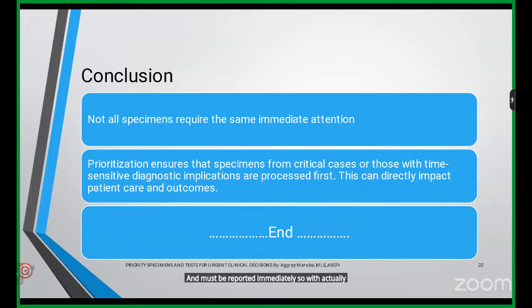So with acute kidney injury, there has to be deranged potassium levels. The first thing you should handle there, don't even consider so much about creatinine and BUN or urea. If there is an indication of acute kidney injury, followed by the state of the patient and indicated in the clinical history, kindly run electrolytes immediately and check potassium.